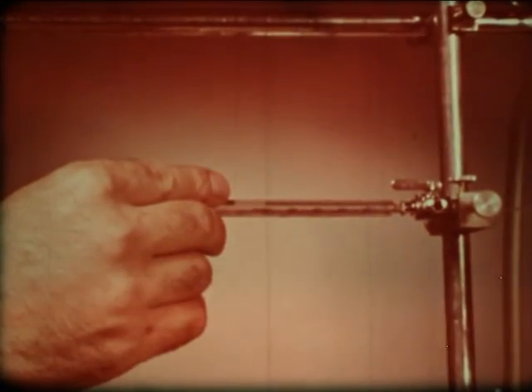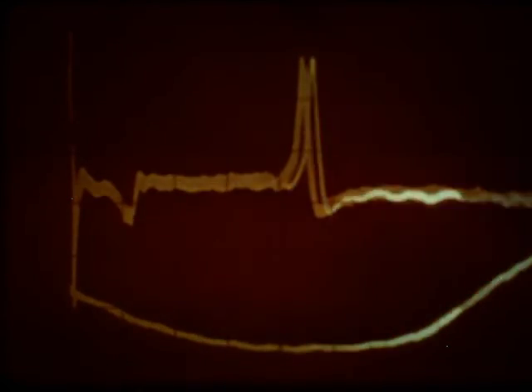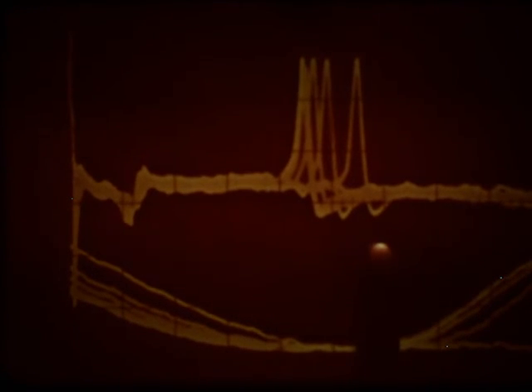Acetylcholine is injected into the driven heart. The progressive effects of acetylcholine on atrioventricular conduction are shown just prior to complete AV block. In contrast to the striking block of AV conduction, atrial conduction was not affected.